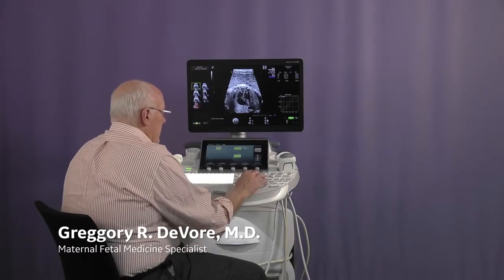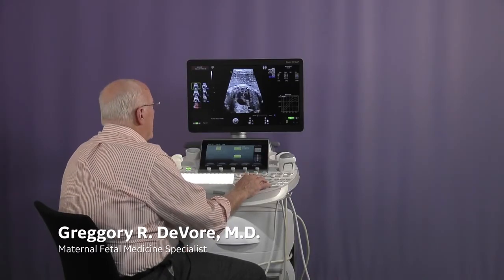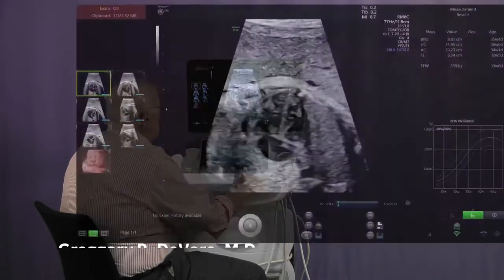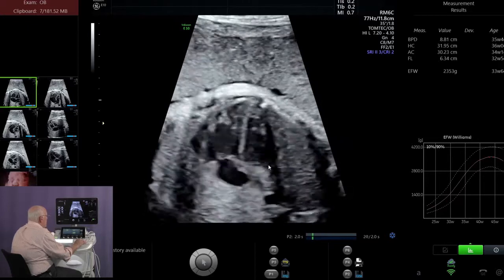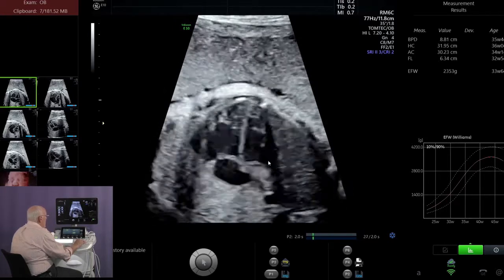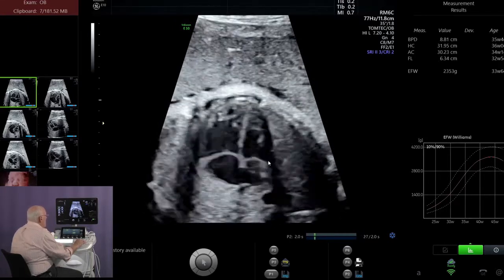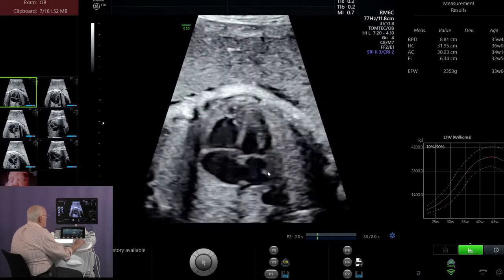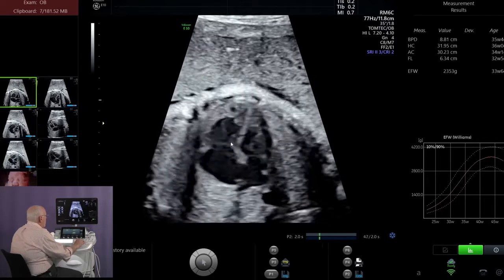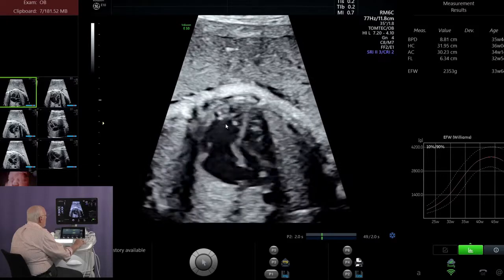Okay, this is a four-chamber view acquisition in which the apex is around 12 o'clock. And what I want to point out is, while this is the orientation used for TAPSE and MAPSE with M-mode, or with tissue Doppler analysis for looking at the base of the heart, it's not necessarily ideal for our Fetal HQ. And the reason for that is, while you can see the lateral wall of the right ventricle here nicely, the septal wall drops out.